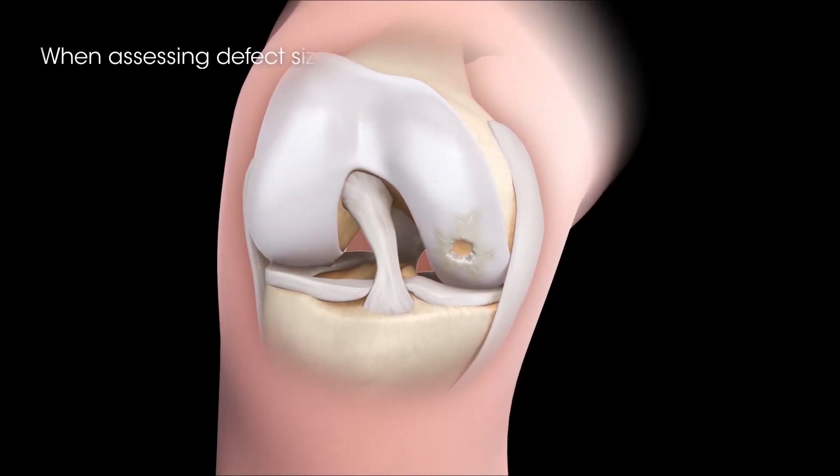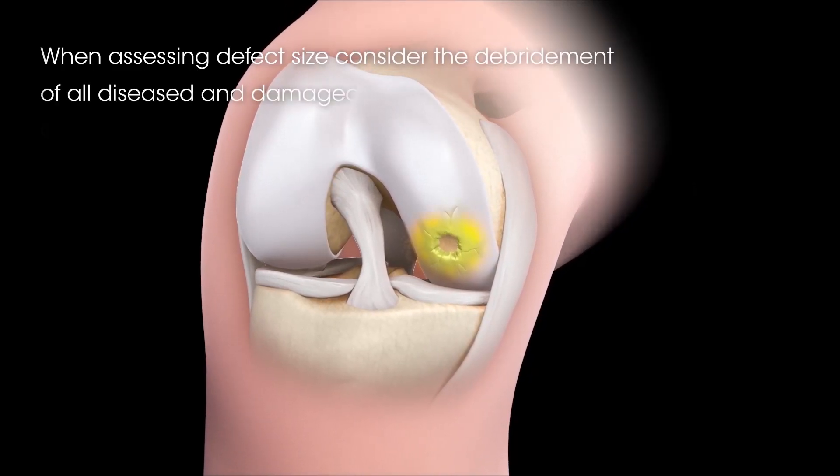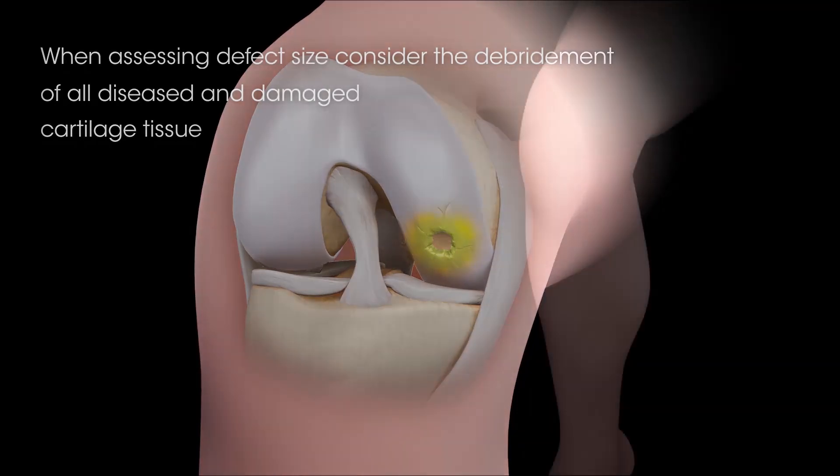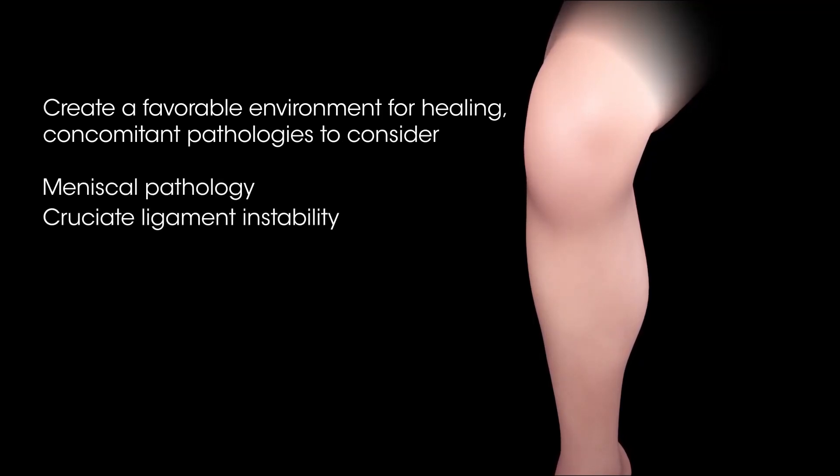When assessing defect size, be sure to consider the debridement of all diseased and damaged cartilage tissue. To create a favorable environment for healing, concomitant pathologies such as meniscal pathology, cruciate ligament instability, and malalignment should be addressed prior to or concurrent with treatment with the MACI implant.